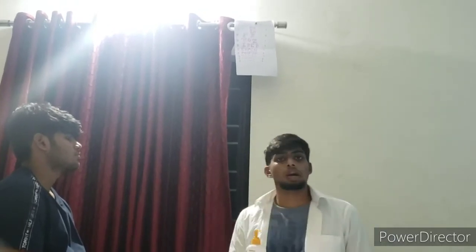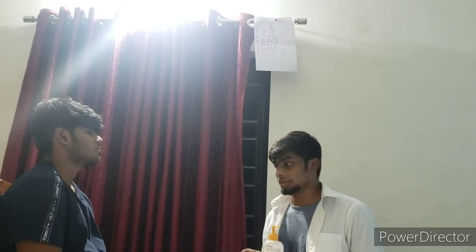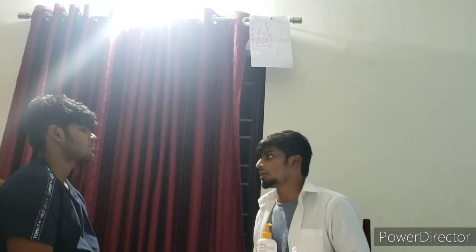Now we will be doing an ophthalmoscopic test. For this test, we have to darken the room. I've set my ophthalmoscope up to the patient's correction. I'm at a distance of 15 inches from the patient, at an angle of 15 degrees laterally.